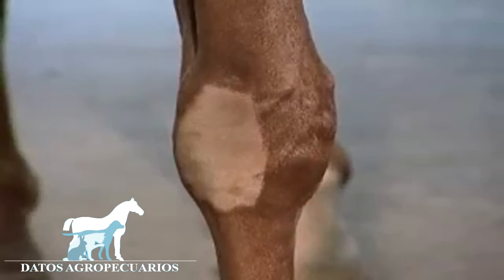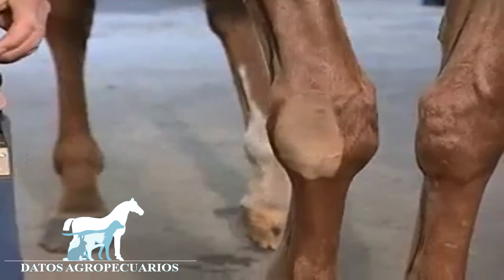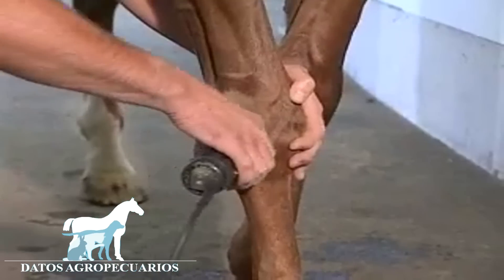After clipping for carpal injections, the leg must be flexed to check that the clipped area covers the injection points, since the skin moves considerably when the leg is flexed.